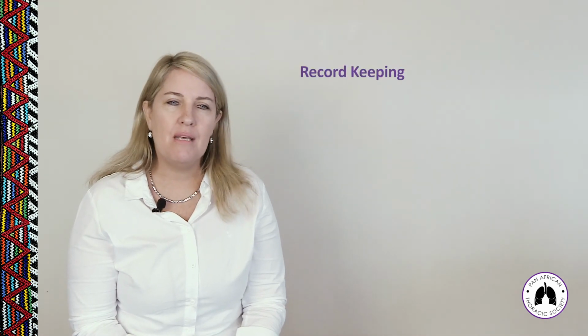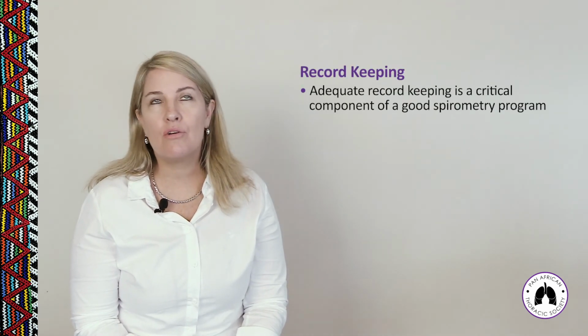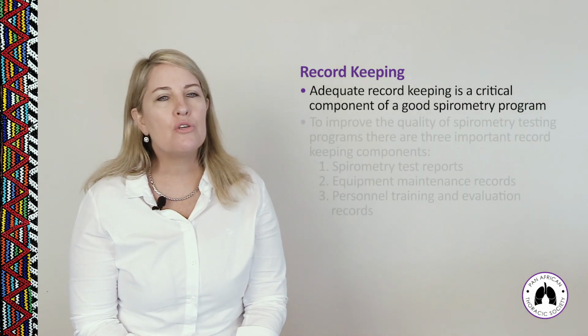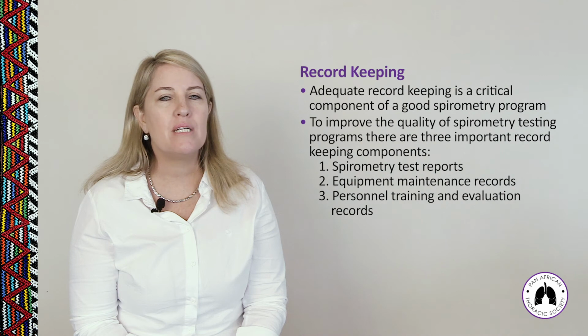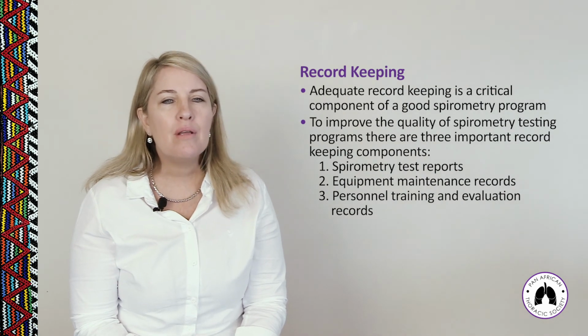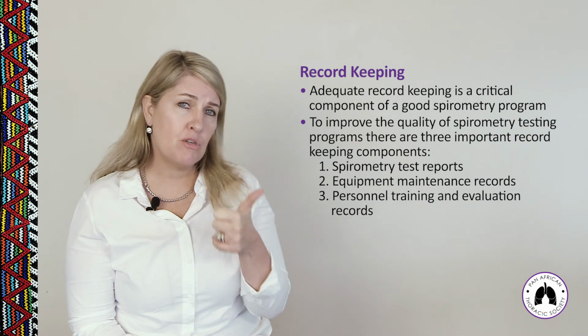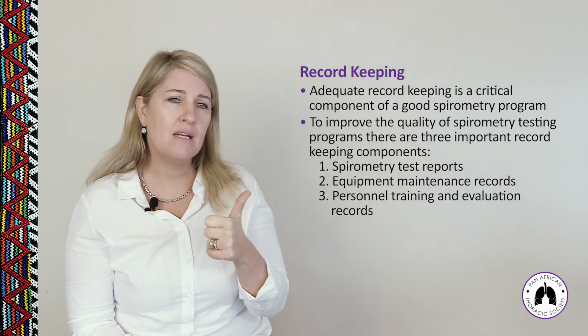In terms of record keeping, adequate record keeping is a critical component of any good spirometry program. So to improve the quality of the spirometry testing program, there are 3 important record keeping components. That is keeping your spirometry test reports, that's the first one.